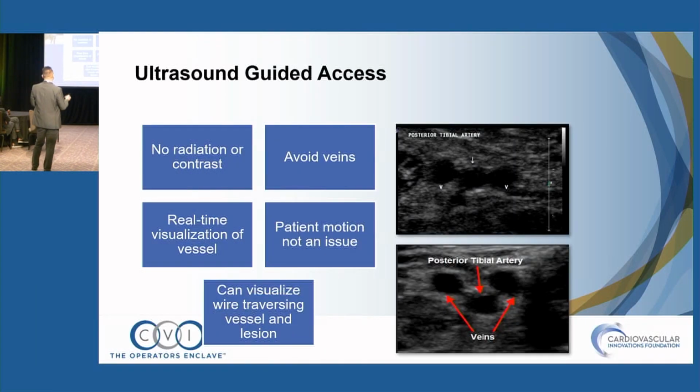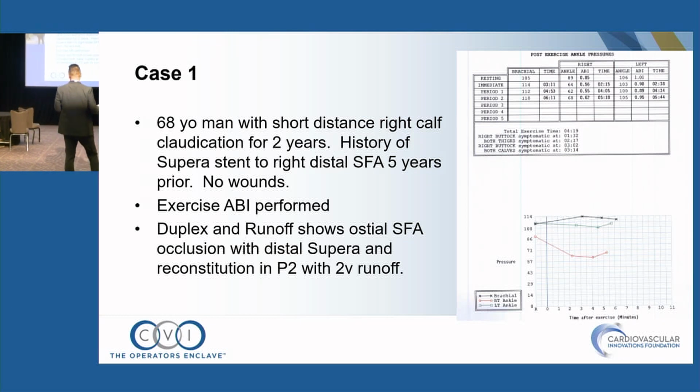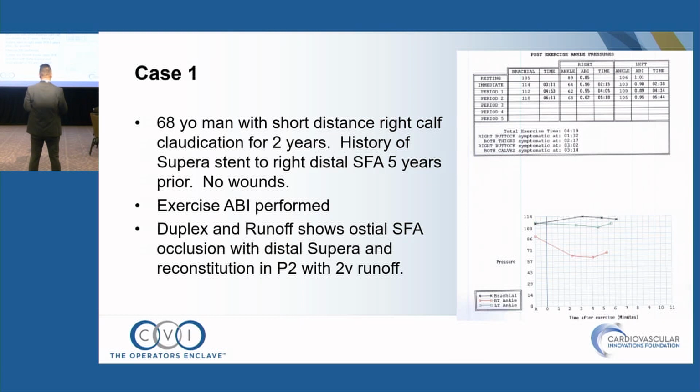So again, like what Dr. Jaafer said, the benefits of ultrasound, again, sometimes you don't have access to it, so it's good to also know the fluoroscopic approach that he was talking about, but ultimately you want to get adept with ultrasound. So I actually had cases on a jump drive on the way here, and I was going to put in new cases, and then I forgot my dongle. So I had to go into my old cases and find some stuff.